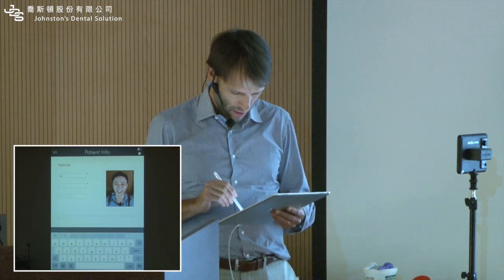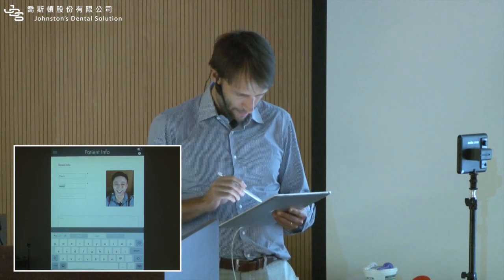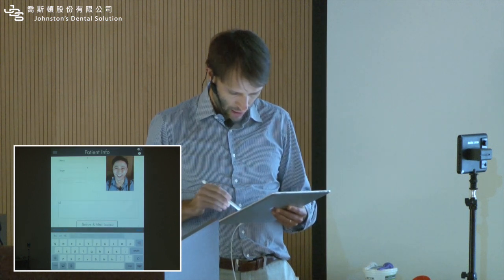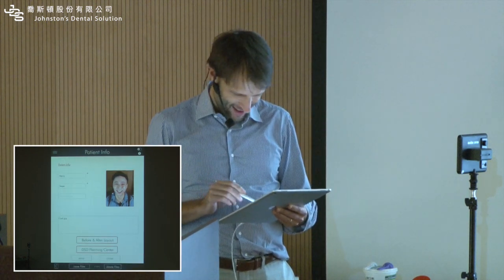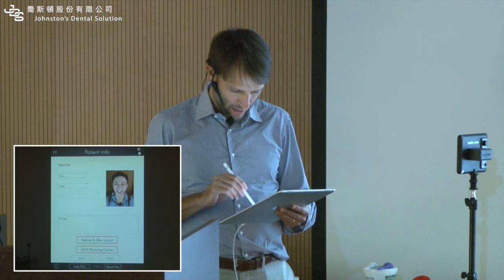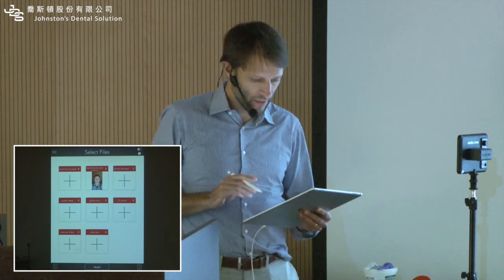So Henry, like this, Taipei. No patient number. We can add any kind of information. Cool guy, nice guy. And we can go to the planning center. Okay, so this is your assistant. Patient is gone. Your assistant is putting the information together.